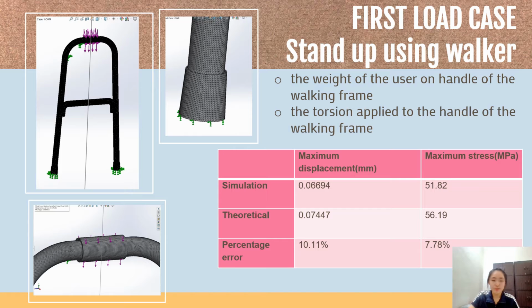This load case is chosen because it is one of the most critical applications for the walker. The type of the load for this load case is the weight of the user and the torsion on the handle of the walking frame. We will show it by using one side of the walker since it is symmetrical. The force on one side of the handle is 343.35 Newton and the torsion is 156 Newton meter. The main impact experienced by the walking frame is at the handle. So, the boundary conditions are the legs and the frame joined to the handles.